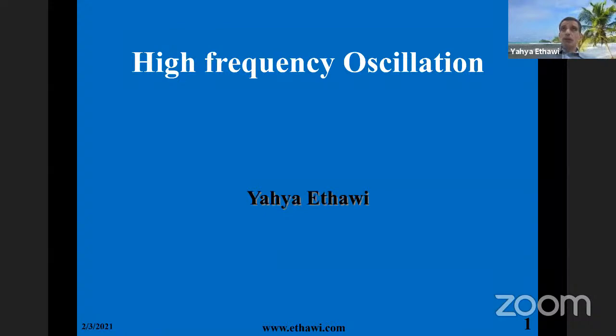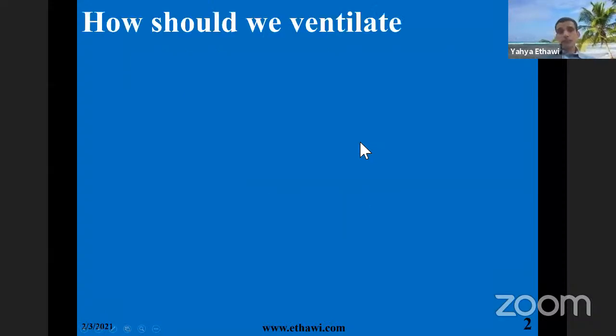High frequency ventilation is of three types: high frequency oscillation, high frequency jet, and high frequency flow interrupter. As most of the Middle East uses high frequency oscillation, today the main talk will be about high frequency oscillation.